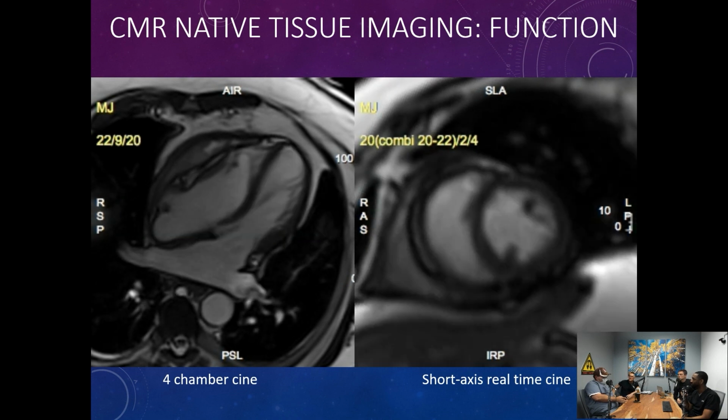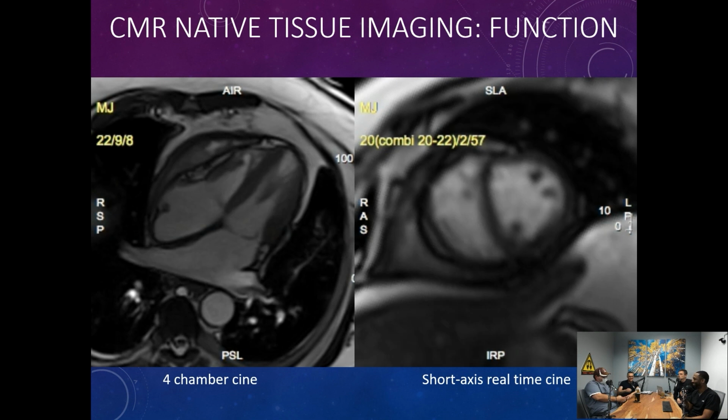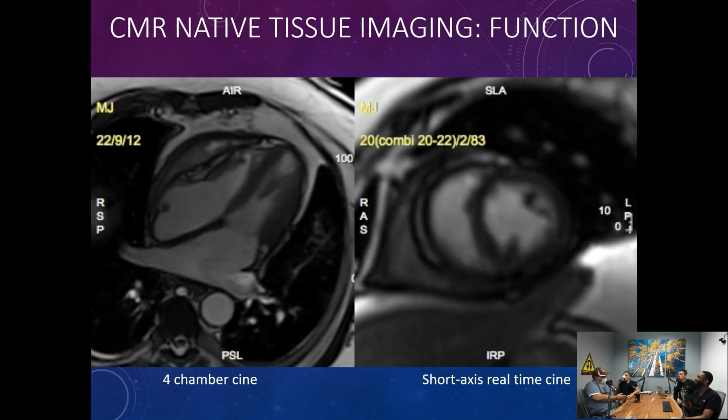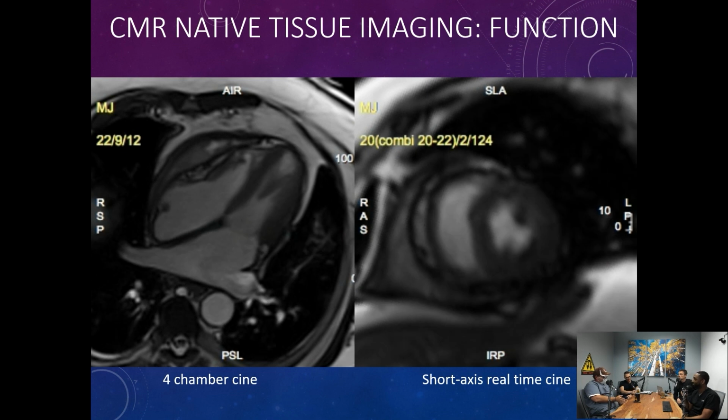It's almost like an arms race when it comes to MRI field strength. The original scanners were less than a Tesla. Right. And 1.5 Tesla came out, then 3 Tesla. Now they have some commercially available 7 Tesla scanners. That's right. And by doubling your magnetic field, you automatically double your signal to noise across the board. Right. But everything else doubles too. So your artifact gets worse. Yeah. You really have to tweak things.